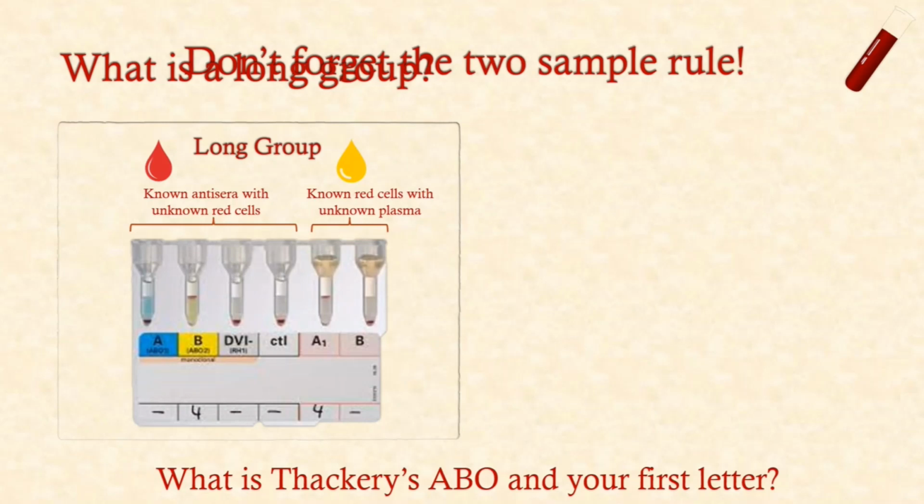So right, so far we've got 97% of people have responded with group B, which is correct. There was a response there for AB. It isn't AB because there isn't the A antigen present, so you're just looking for what antigen is present in your forward group, and then what corresponding opposite antibody is there in your reverse. But a lot of this is done on automation as well. If you were doing manuals, you would always do a second check and get someone to check that for you.